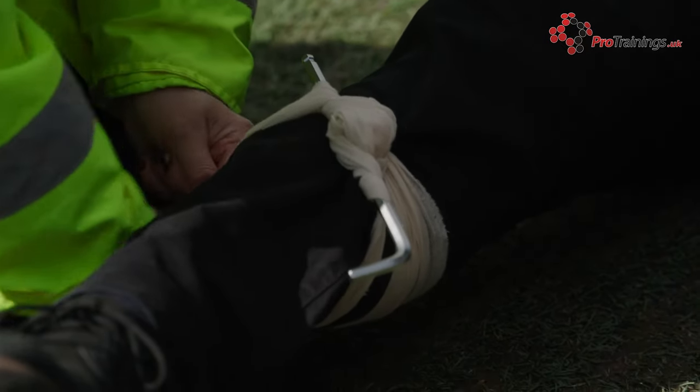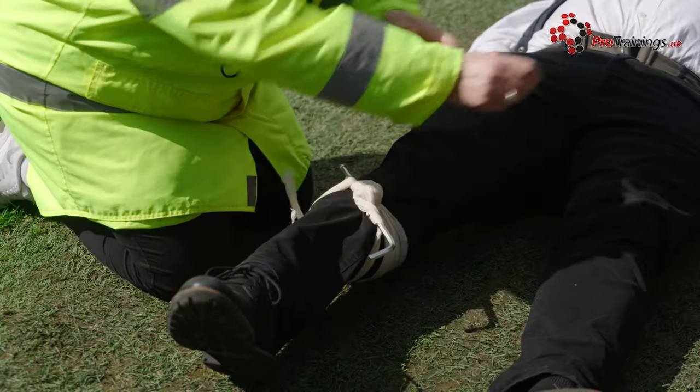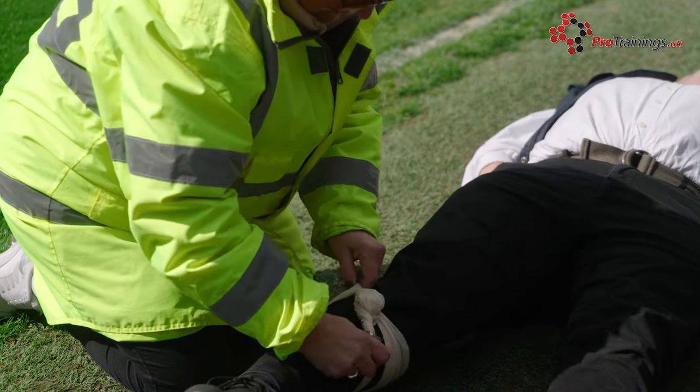Tourniquets are only removed by a doctor in a hospital under controlled circumstances. If you need to, you can add a second tourniquet and place it above the first one. Note the time that you have applied the tourniquet and tell this to the emergency medical services. Once you have applied the tourniquet, look after the patient — keep them warm and keep talking to them.